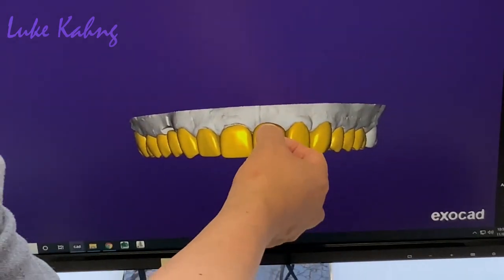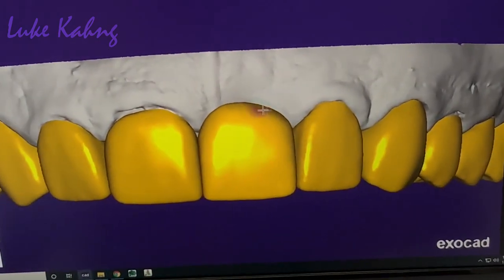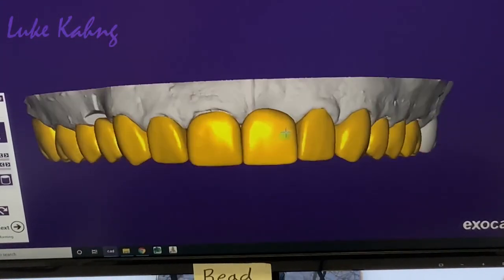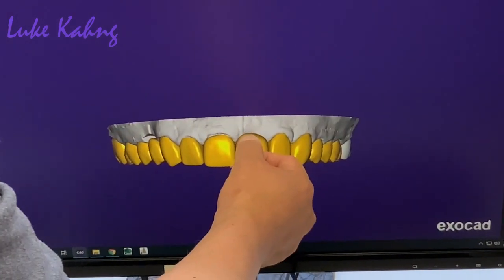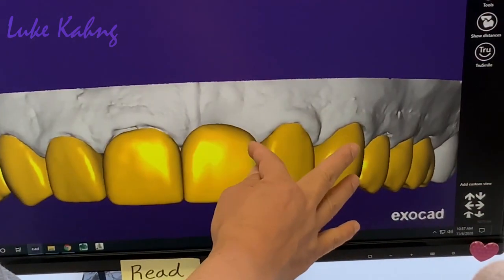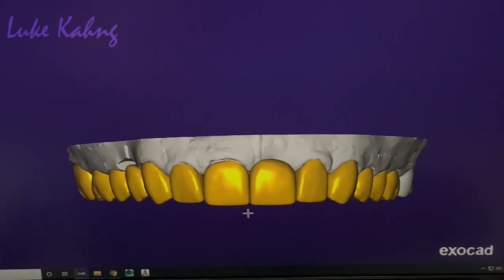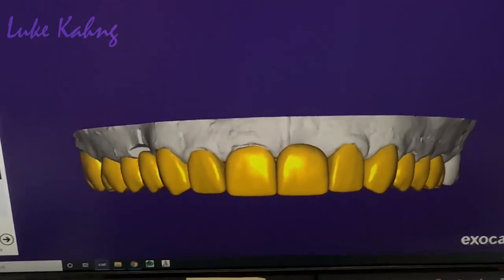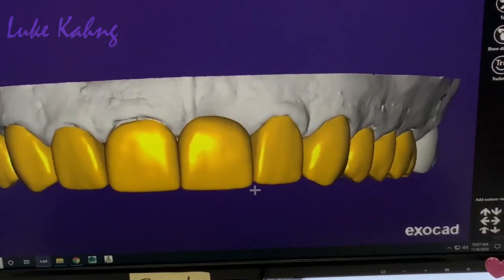Now I'm going to grind it here just like this. Bring down. Yep. Okay, now this. Yep. Even better. So whenever you see, this is a little shorter, so make it slightly longer. Yeah, okay, better. Still this is lower. Longer.